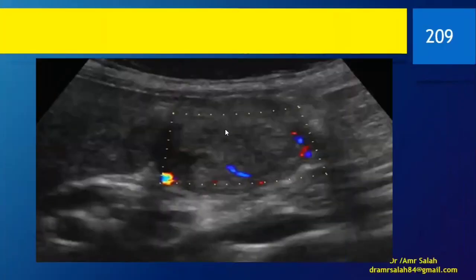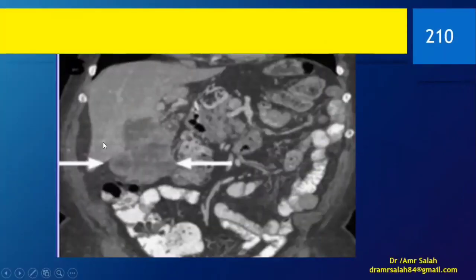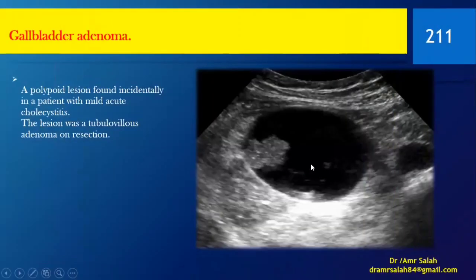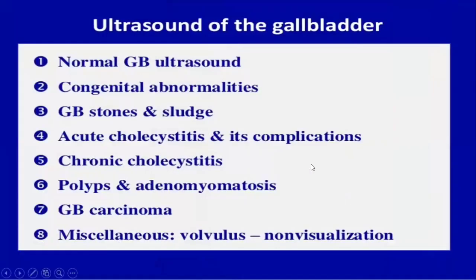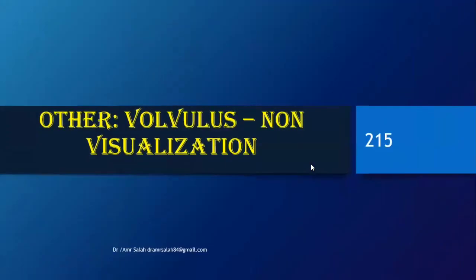It is important to note the risk factors. Here, it is vascular. It's more than 1 centimeter. Look at this. This is huge. This is cancer. Okay, this is adenoma. This is invasive cancer.